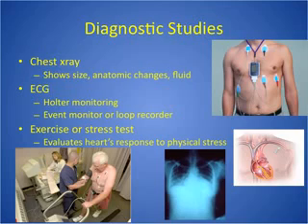Typically, if we suspect an MI, then an ECG is done serially, meaning in succession. So usually every 2 hours, maybe every 4, maybe every 6 hours. And we look for changes, and so we can see changes in the pieces of the ECG, the QRS, the ST, the T wave, and we see those things with ischemia. We see a pathologic Q wave with a STEMI and no Q wave with a non-STEMI. All things you'll learn about in dysrhythmia and the video about acute coronary syndrome.